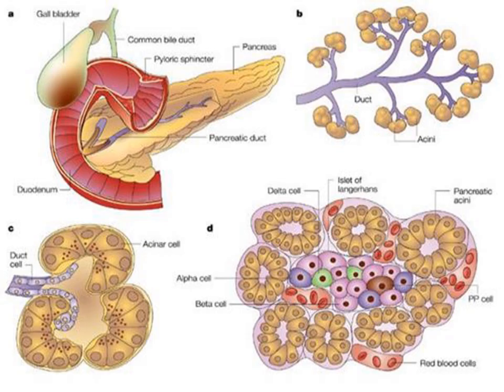Here in this picture you can see both parts of the pancreas. You can see the exocrine portion and the endocrine portion together. In the middle there are alpha cells, beta cells, and the capillaries surrounding them from outside, and also delta cells inside. In the middle is the islet of Langerhans, and it is also surrounded by pancreatic acini and acinar cells. This is very clear.